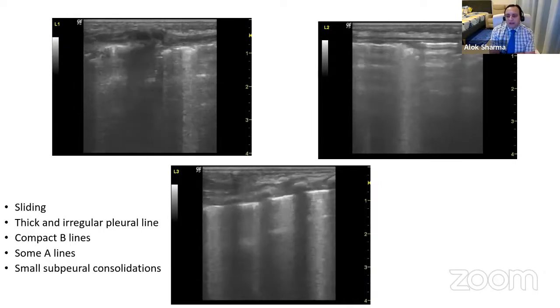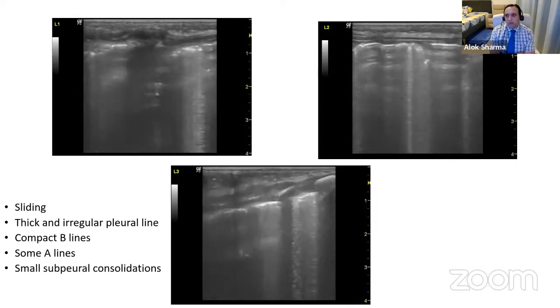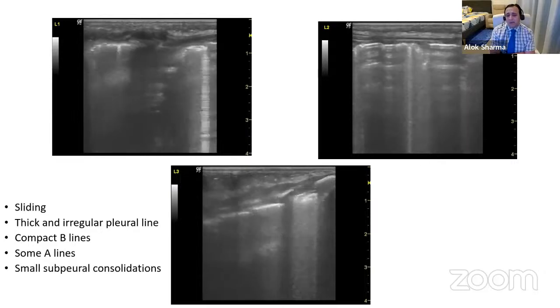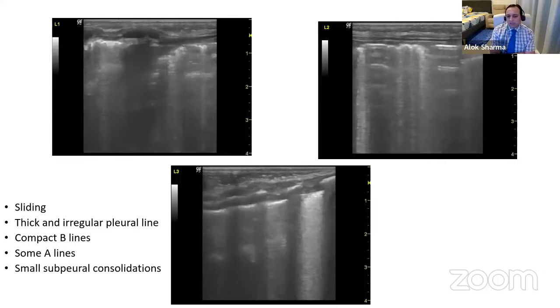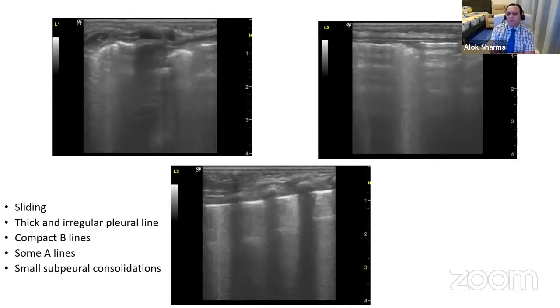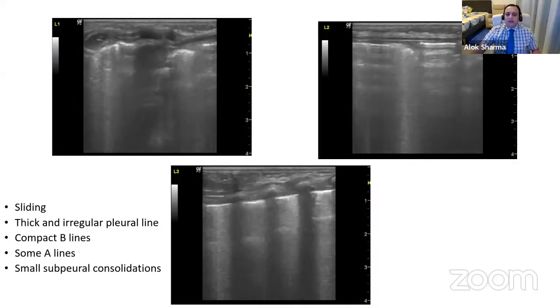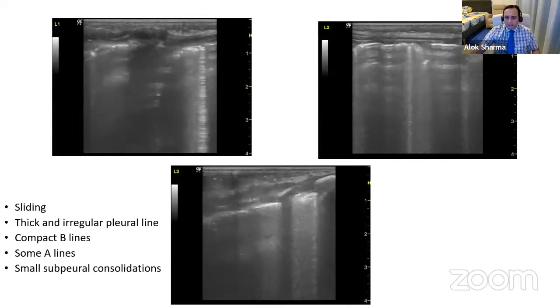Again, I would like to emphasize that a double lung point is not pathognomonic of TTNB alone. A double lung point can be seen in a large number of conditions where there is healing: RDS after surfactant, meconium aspiration, even pneumonias that are improving. What it represents is a sharp demarcation between the superior and inferior lung fields. Again, very nice pleural sliding seen in all these areas. With B lines, you cannot have a pneumothorax in L3.